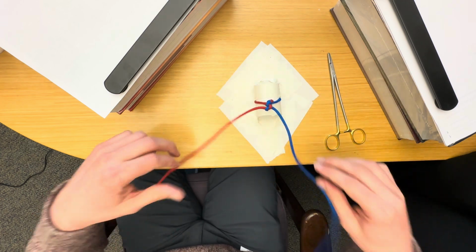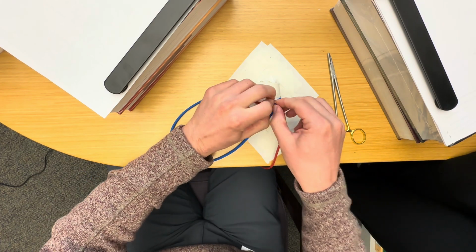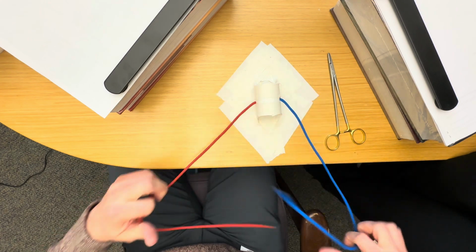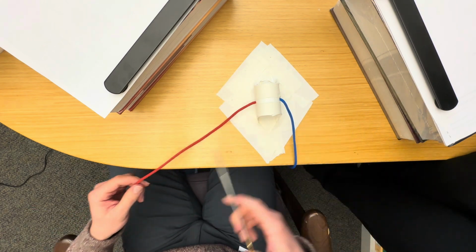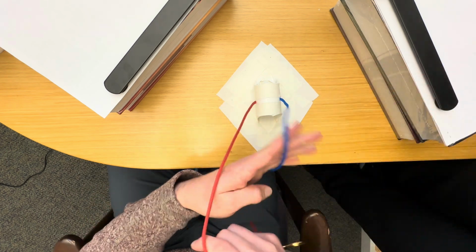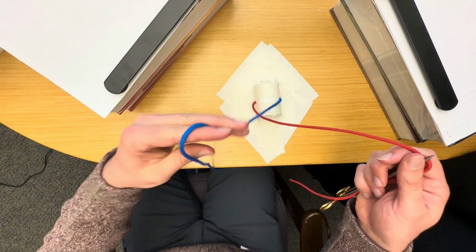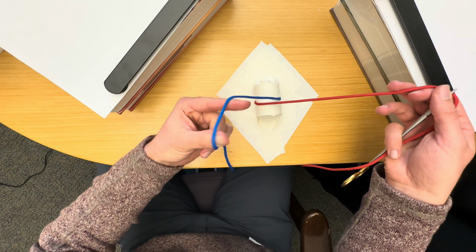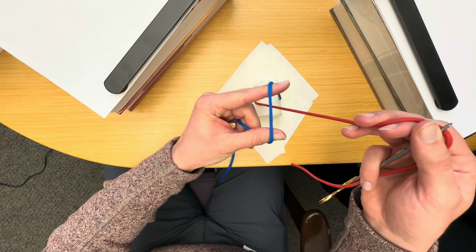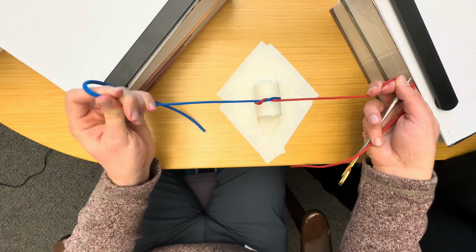I'll do one other quick example of if we were crossing, when we do our initial cross, whether we would go over versus under. So same thing, you have your needle in your right hand, you throw. This time, instead of going over, you're going to come under, and so instead of starting with the karate chop like this, you're going to start with the C. Since your needle with needle driver is under, you have your tail over your thumb and forefinger on your left. You bring it to the middle, bring your index finger through, pull it down like that.